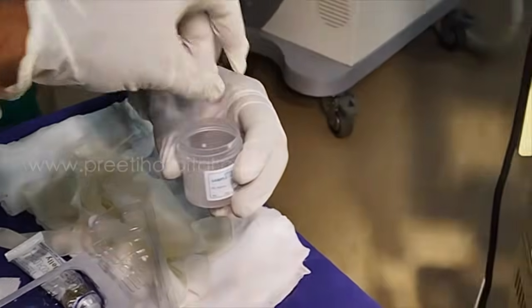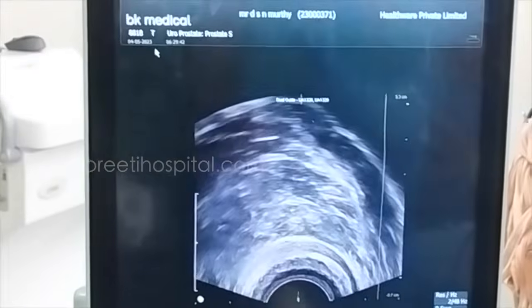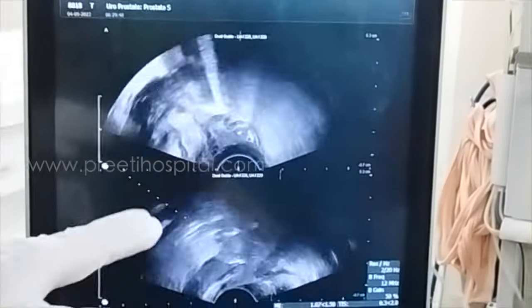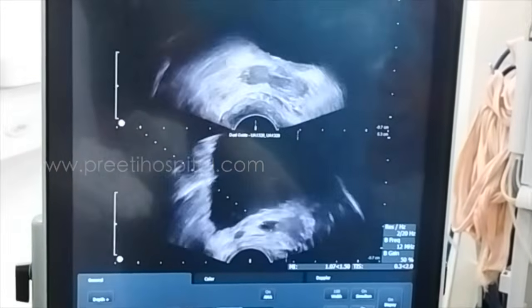Yes. So right side base, can you change the position now? Now you will go to sagittal. Transverse and sagittal, you keep both. Now you are coming in transverse, go inside. Rotate, because you are rotated to the opposite side. I have rotated the opposite side. Now you are coming.